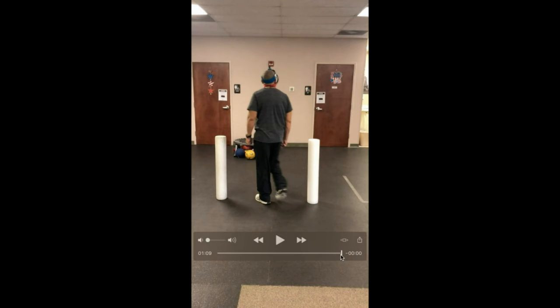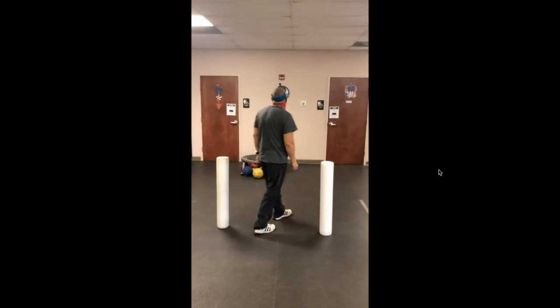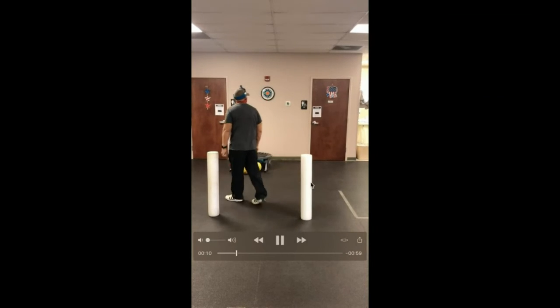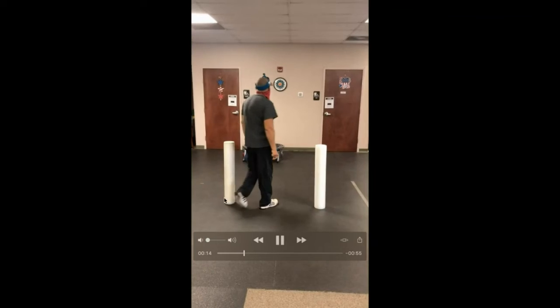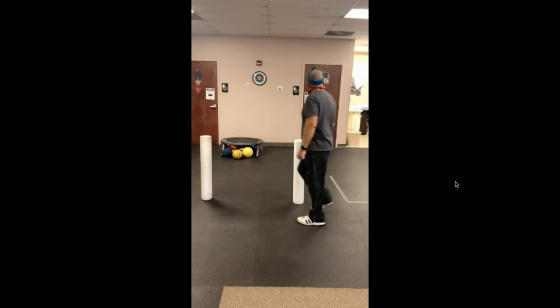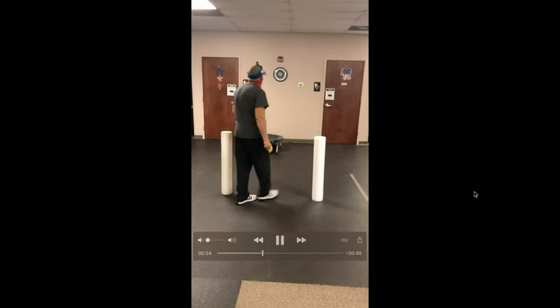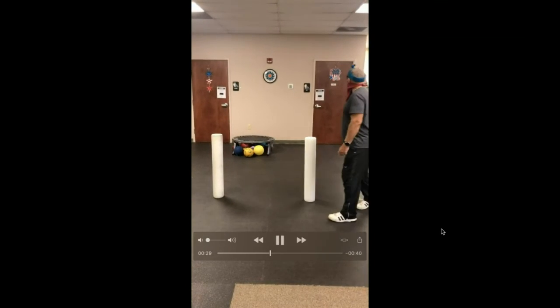So if we look through that again, we can start maybe here. So look at the lag, and when that laser actually gets back on there, he's already past the foam roller on this side, and he's at the foam before the foam roller on this side. So we have a little excursion measurement that we can go through there, a distance measurement. And again, he just can't get that right rotation coming back around. His visual field is not fixating quite as well on that target as he comes back around that side.